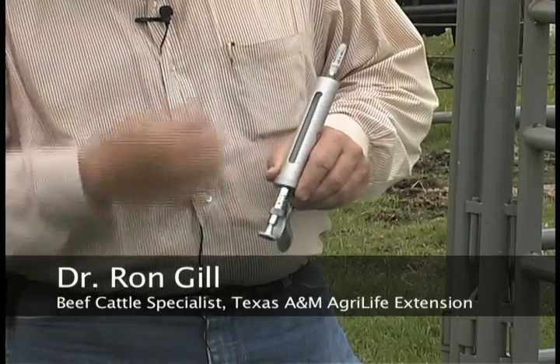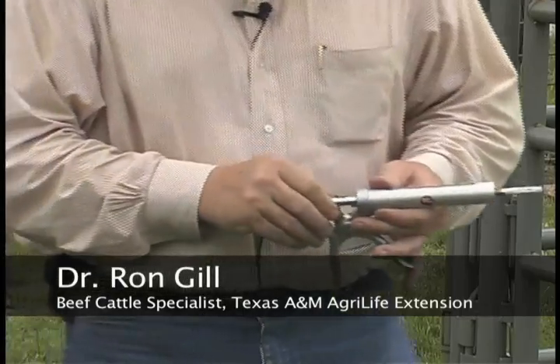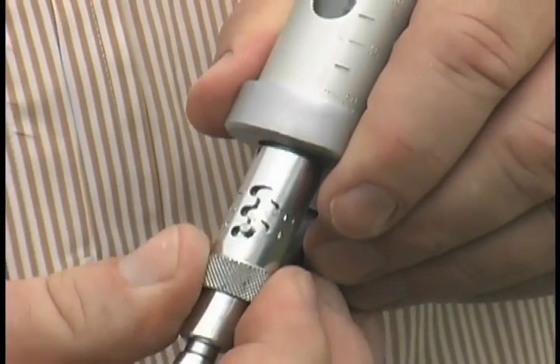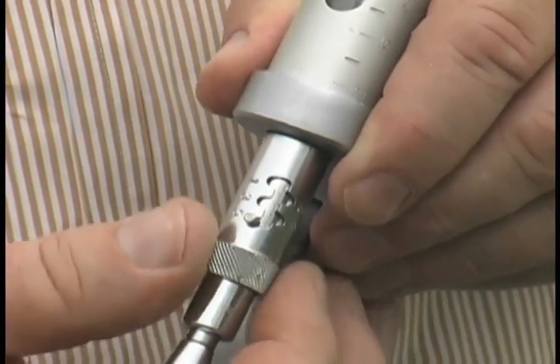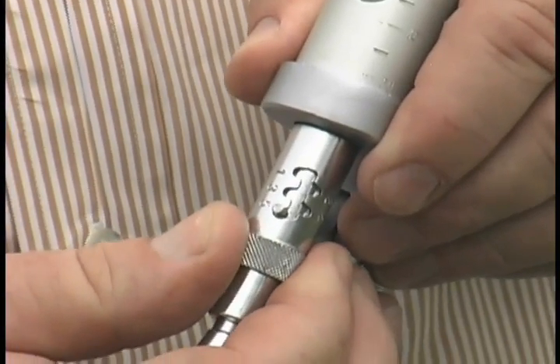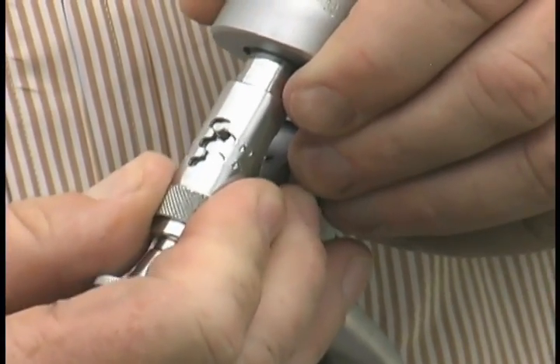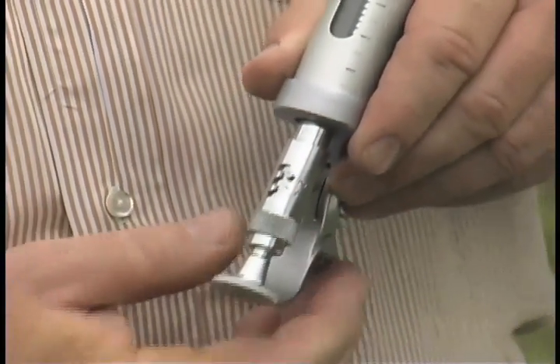These syringes are gauged to where you can change the dose that you're delivering to the calf. It ranges anywhere on this syringe from one to five in one cc increments. The products we'll be giving will be a two cc product, so you'd set it on two.